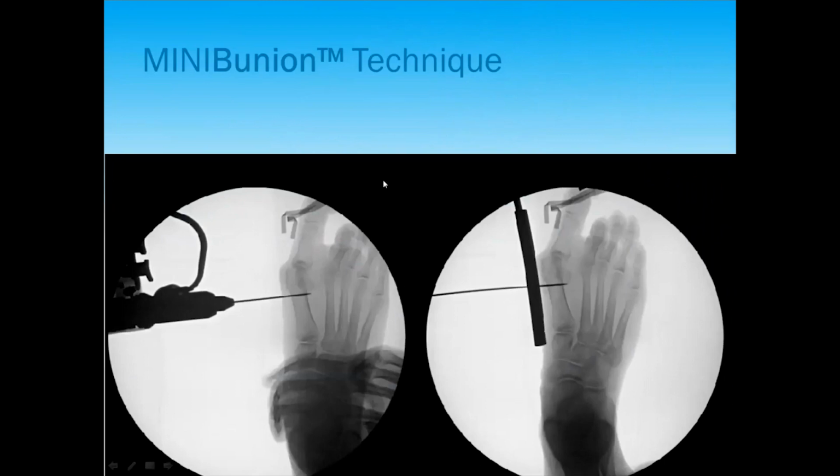So what's the technique for this mini bunion implant? How do I do this? Well, it's a 1.6 millimeter wire that we use to drill across the neck of the first metatarsal. This is done under fluoroscopy, and that ensures the level of your osteotomy.